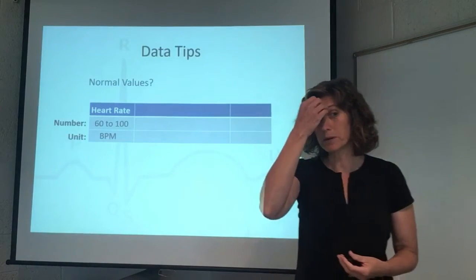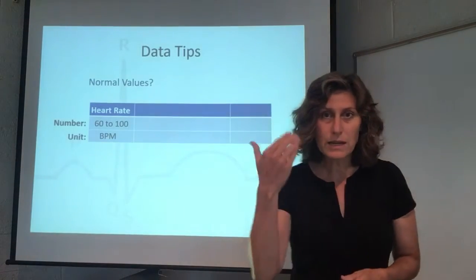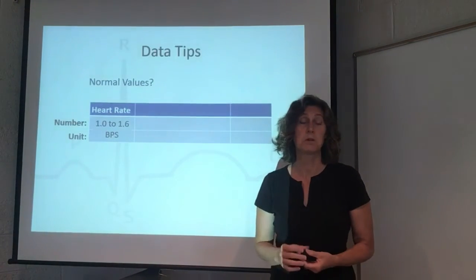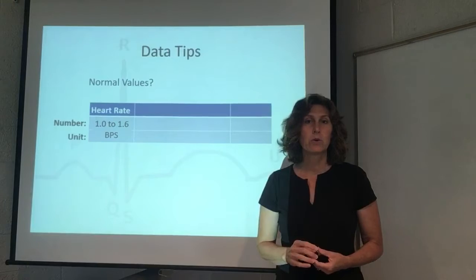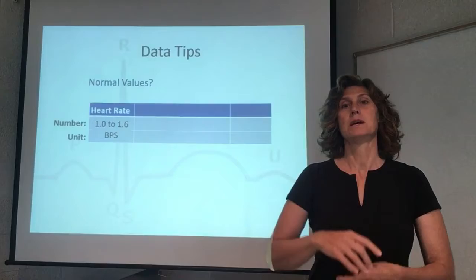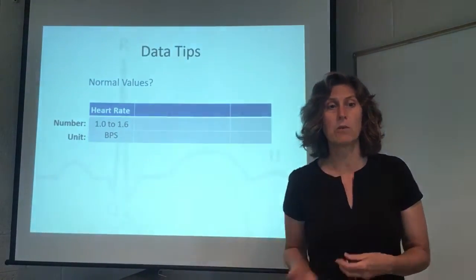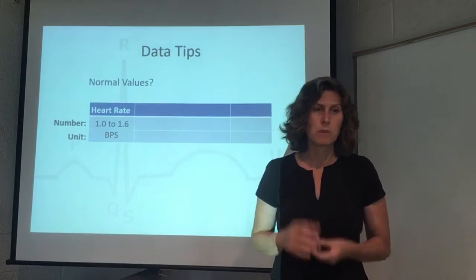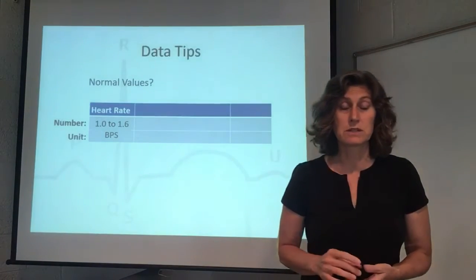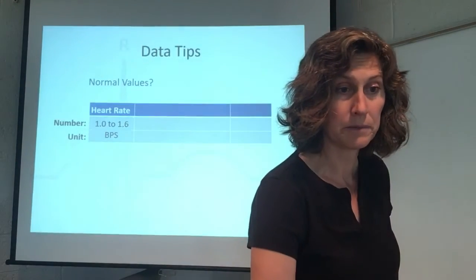This 60 beats per minute is a helpful number because there's 60 seconds per minute. So if you needed to conceptualize it down to the second level, you could actually do it. That corresponds to about 1 beat per second. So heart rate is kind of a nice feature. It's something we can have a very intuitive sense of because we have a sense of what a second is. Now, if it was 100 beats per minute, that would be 1.6 beats per second, excuse me. So again, that's something to have an intuitive sense of. It's more than 1.5 beats in a single second.